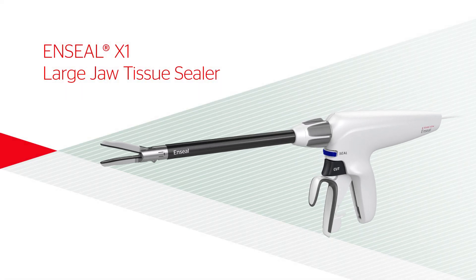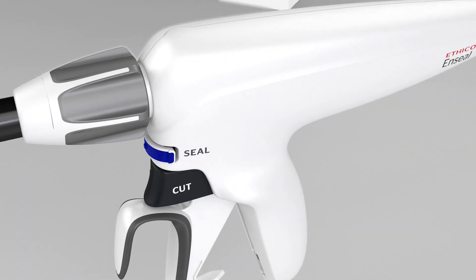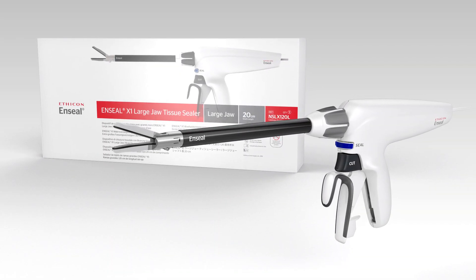Nseal X1 Large Jaw Tissue Sealer. Indications: The Nseal X1 Large Jaw Tissue Sealer is a dedicated bipolar electrosurgical instrument intended for use in open surgical procedures where ligation and division of vessels is desired.